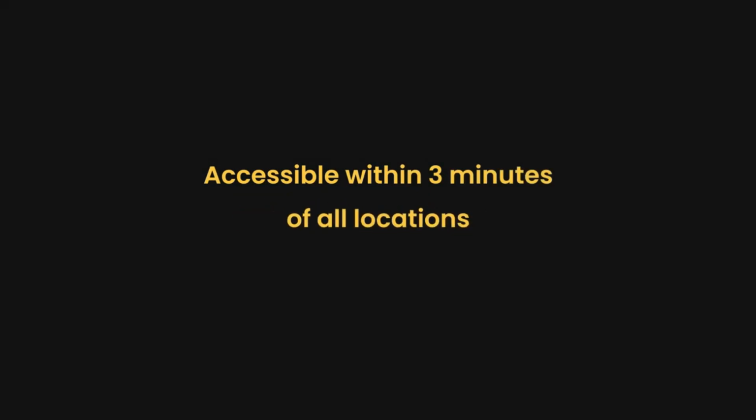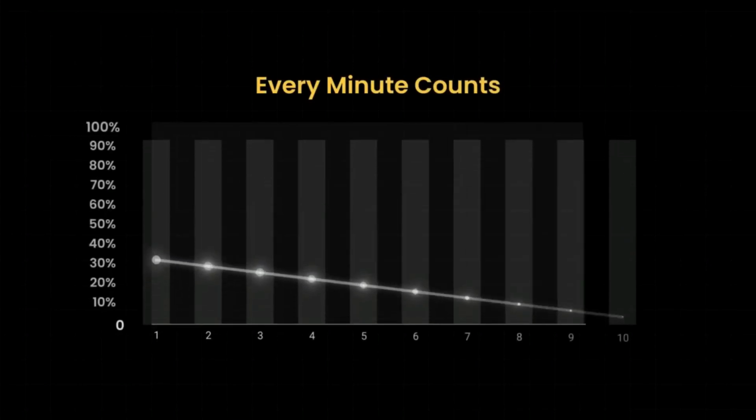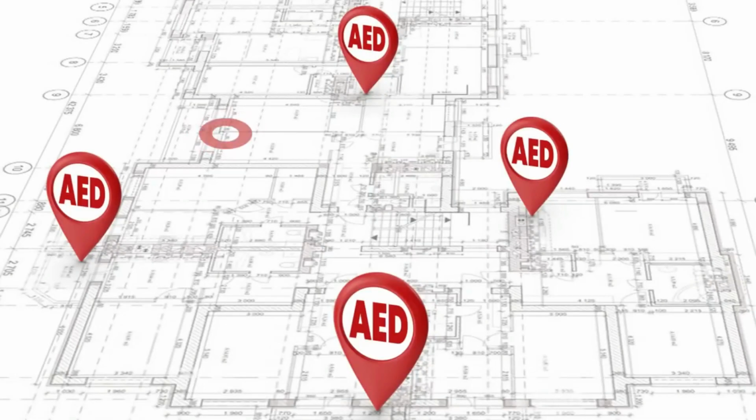Now that we've taken your AED out of the box and set it up, let's talk about some next steps to ensure that you're always prepared for a sudden cardiac arrest emergency. The first thing we want to talk about is how many AEDs do you have? We recommend that AEDs should be accessible within 3 minutes of all locations. Every minute that goes by without being shocked by an AED drops survival rates 10%. That means when a sudden cardiac arrest emergency occurs, someone should be able to go to the AED and back to the emergency within 3 minutes.